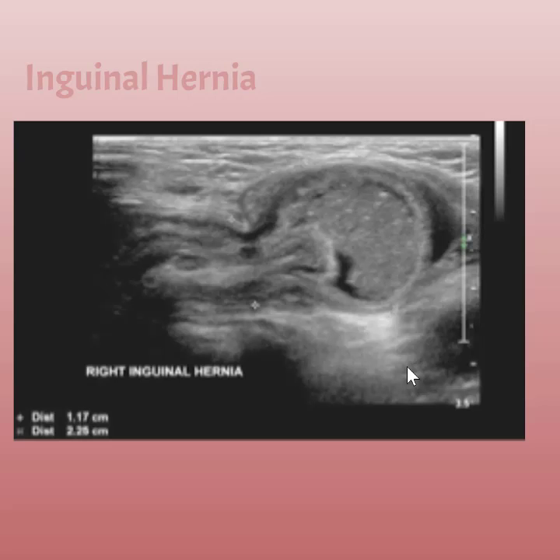So here's an example of an inguinal hernia. The calipers on here are showing the defect in the wall, the neck of the hernia. So this is all bowel that is coming through and bulging into what looks like the top of the scrotal sac. If this was a live picture, we would see peristalsis through here. We would see the bowel matter moving through and kind of looping around. We want to put color on this, make sure that this area is still getting blood flow. So determine if it's incarcerated or not. Can we get it to go back to where it belongs?